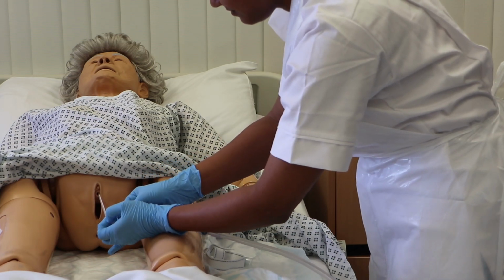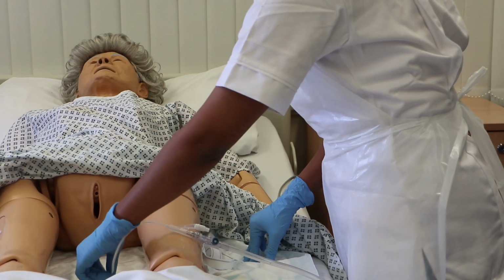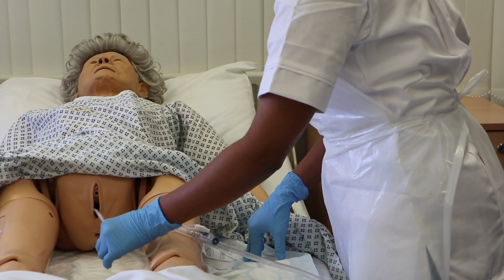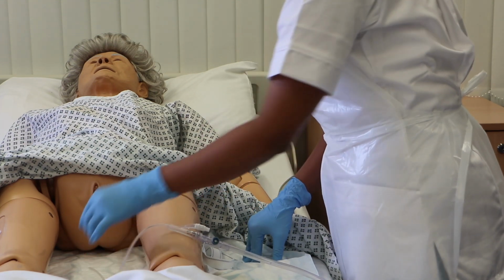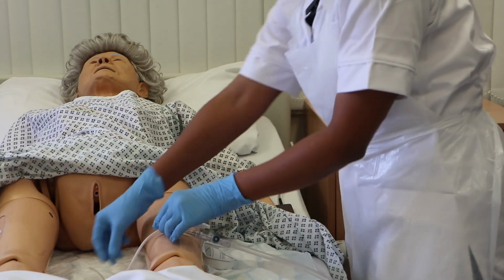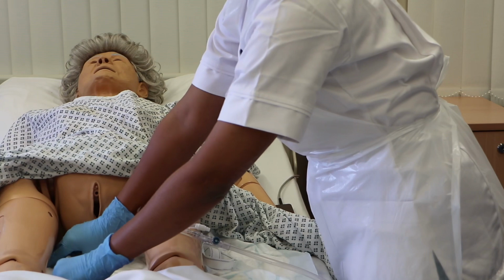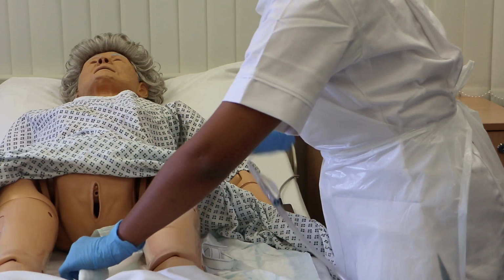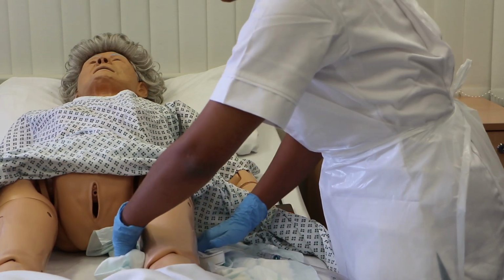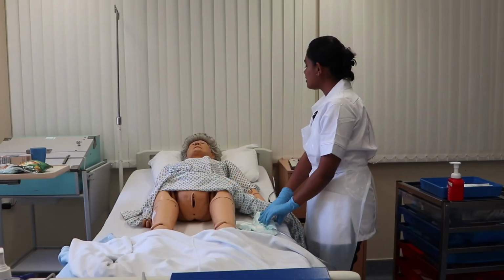Now I am going to check the tip of the catheter for any blood, debris and any signs of infection. There is nothing. And now, Grace, I'm going to change the inco pad. Are you okay with that? Yeah. Okay. Removing the inco pad. And I will clean the meatus using a saline soaked gauze. Grace, are you still comfortable?